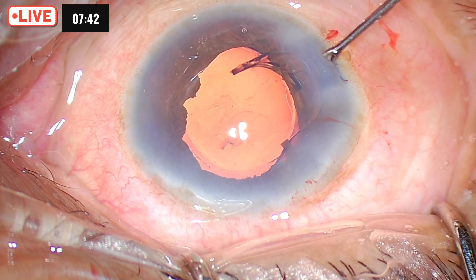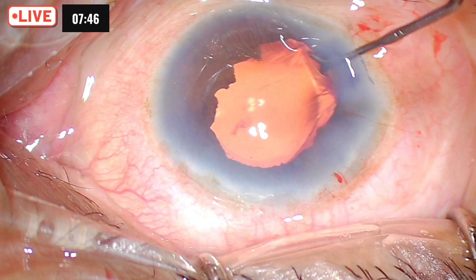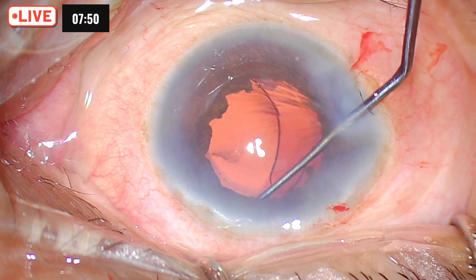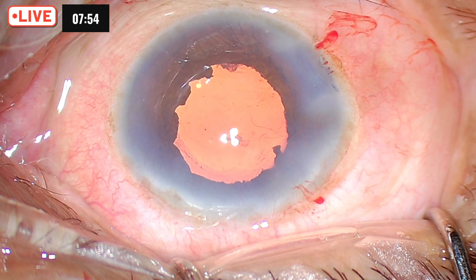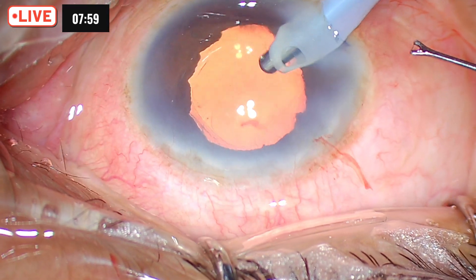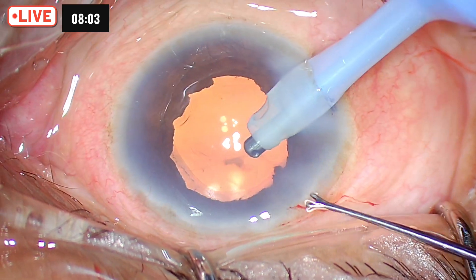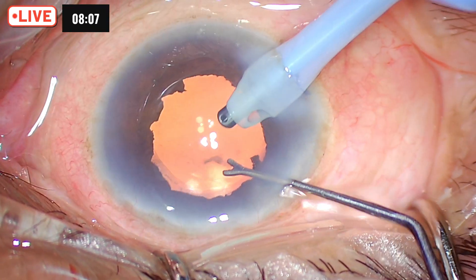While dialing the IOL, you have to be very careful in a pseudo exfoliation case. Make sure that you engage properly. This kind of maneuver is far safer than dialing the whole lens in, because you are bending the loop — and there, less pressure on the capsular bag.